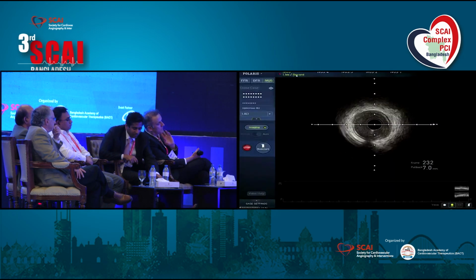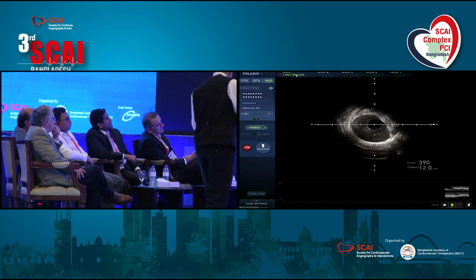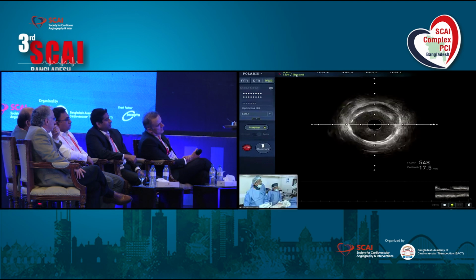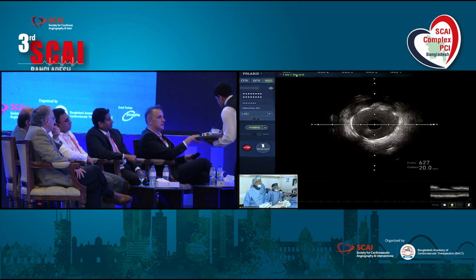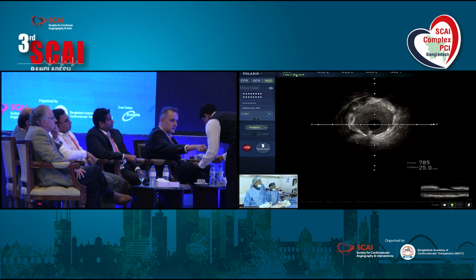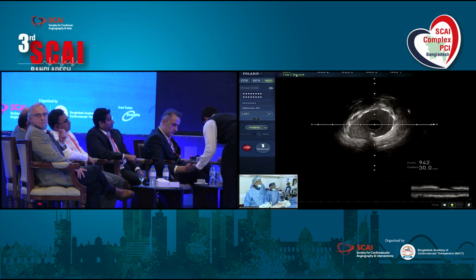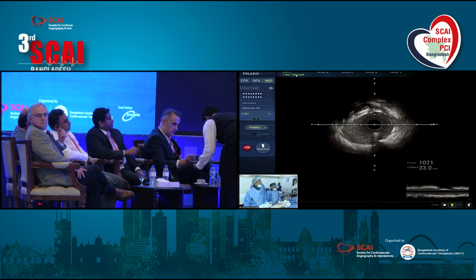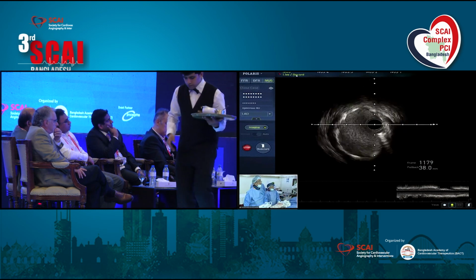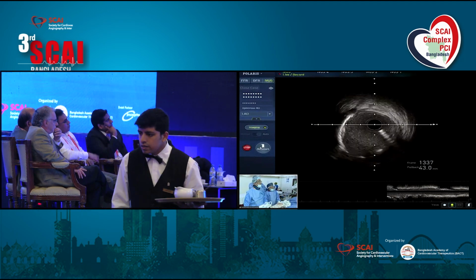Then the IVUS, okay, that's the IVUS now for final. Final IVUS for LAD. That's okay. There's still some plaque, and I don't think here you need to be aggressive to post dilate any further. I think in my practice, I'll finish it here. Well expanded. Okay, I think everything looks so good so far, and this is the proximal segment where we went with the 4.5.